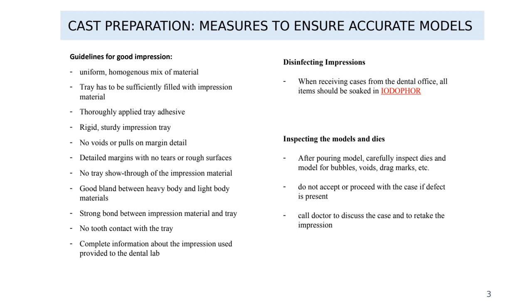Inspecting the models and dies. So after pouring the models, carefully inspect the dies and models for bubbles, voids, drag marks, etc. Especially pay attention to the prep area, the preparation area, and the margins. Do not accept or proceed with the case if defects or voids are present. Okay, call the doctor to discuss the case and retake the impression.